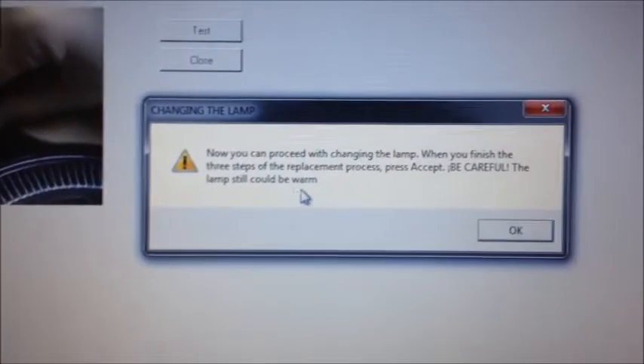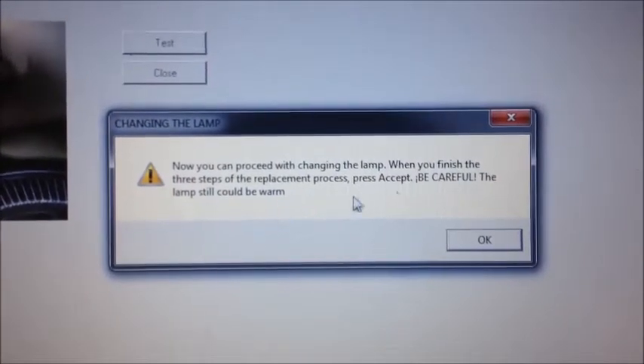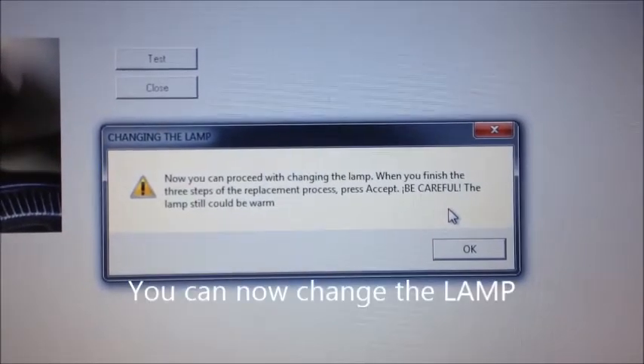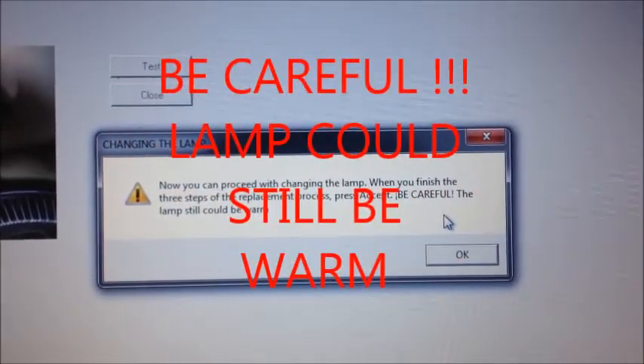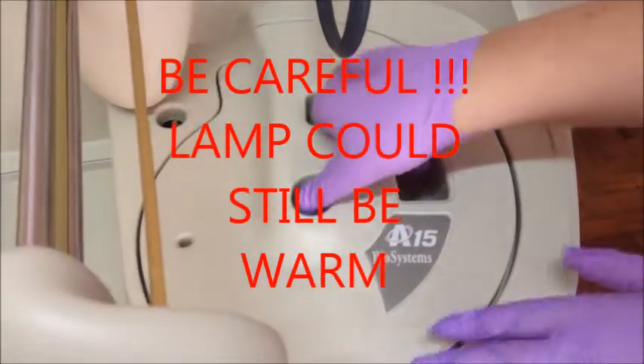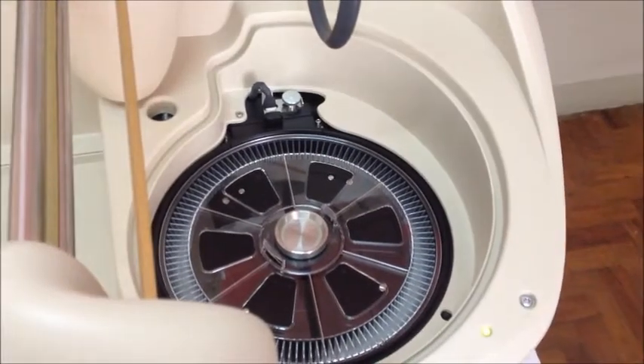Follow the instructions on the screen. As a reminder, be careful as the lamp could still be warm. First, remove the rotor cover and the reaction rotor as well.